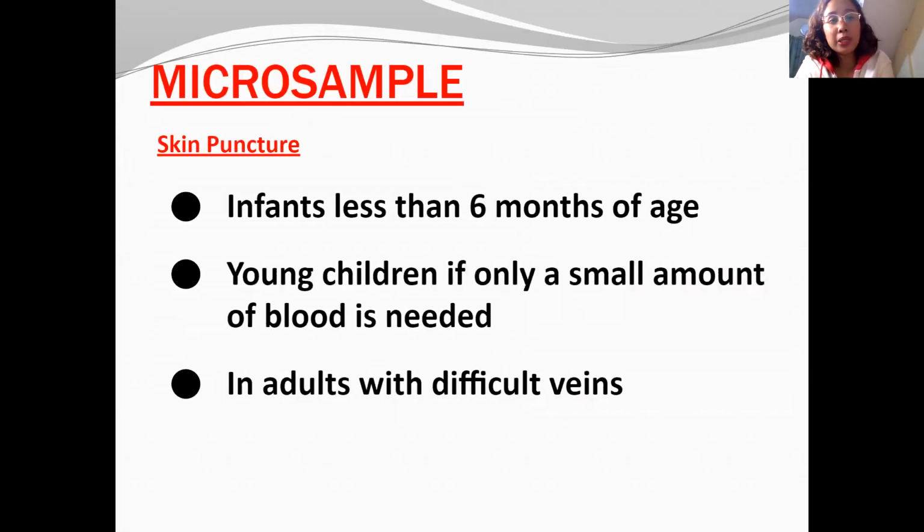So let's begin with microsampling. Guys, microsampling, you can't do without it in the laboratory.